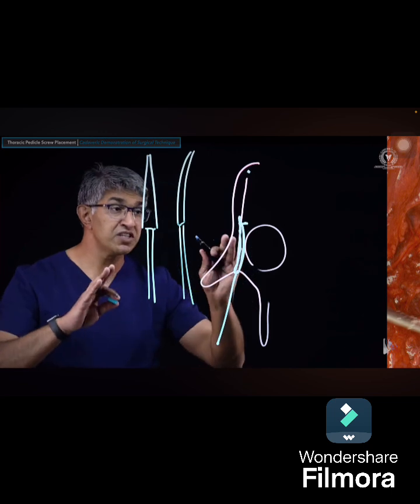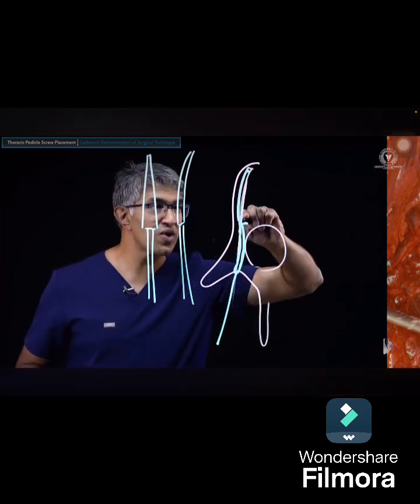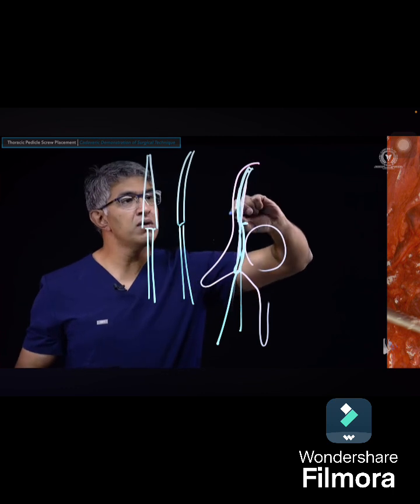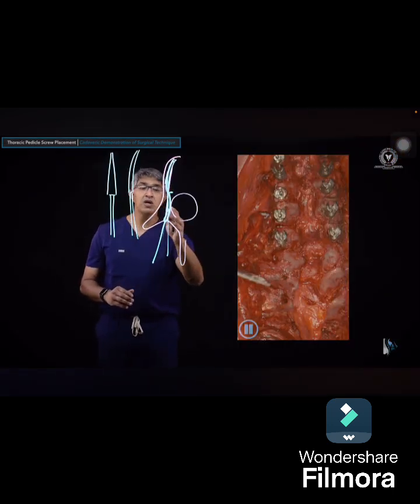You get to a depth of about 15 to 20. Most people say 20, and then remove it and switch the bevel so that the convexity is directed laterally for the ventral portion of it. So here, when you put this in, you don't necessarily medialize it aggressively. You put it in more or less straight and hope that the bevel bounces off the lateral edge of the vertebral body. That is the technique for cannulating a pedicle using a curved gear shift.